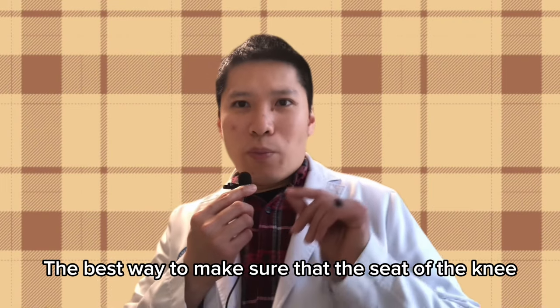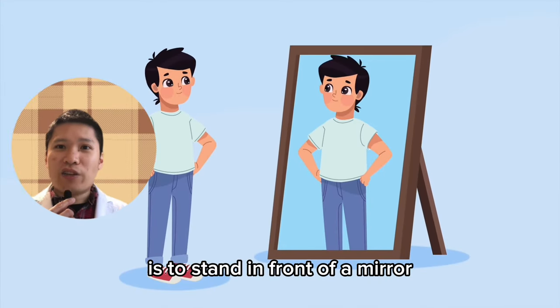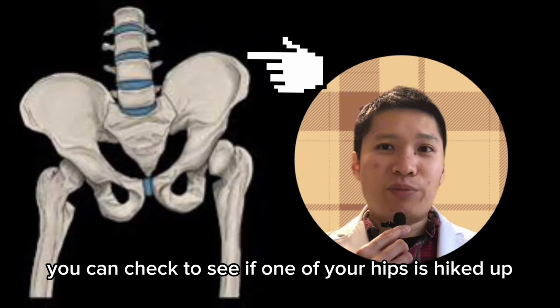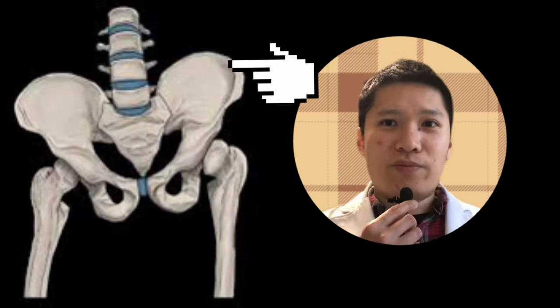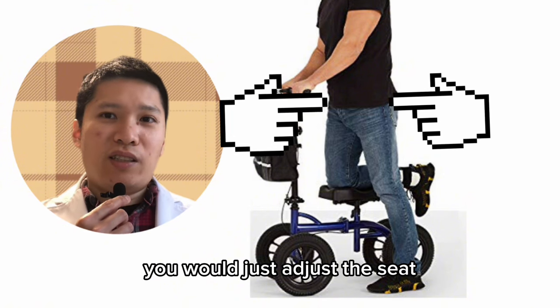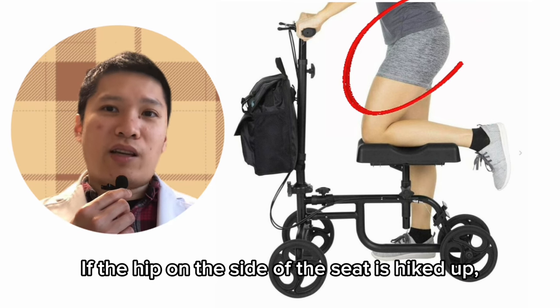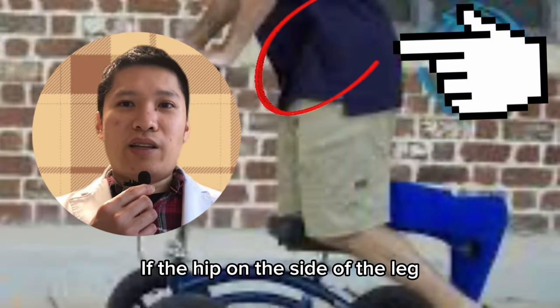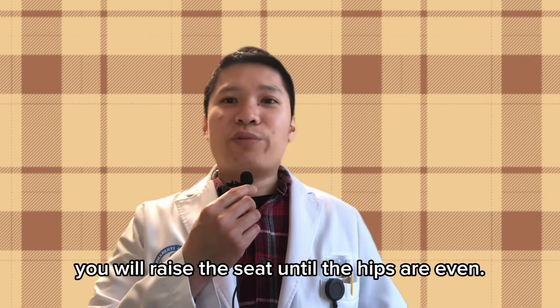The best way to make sure that the seat of the knee scooter is at the proper height is to stand in front of a mirror with your knee scooter. This way you can check to see if one of your hips is hiked up while your knee is resting on the seat. If one hip is hiked up, adjust the seat until the hips become even. If the hip on the side of the seat is hiked up, lower the seat. If the hip on the side of the leg on the ground is hiked up, raise the seat until the hips are even.